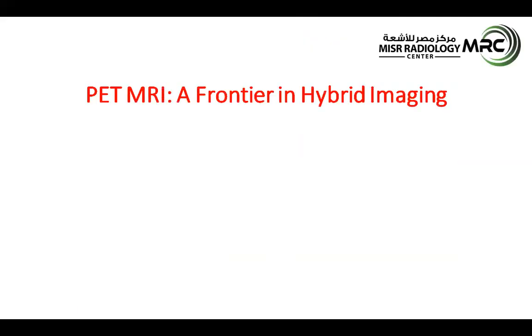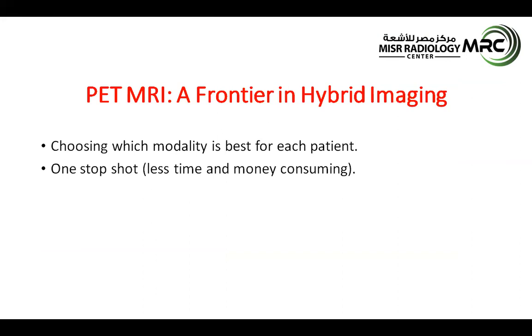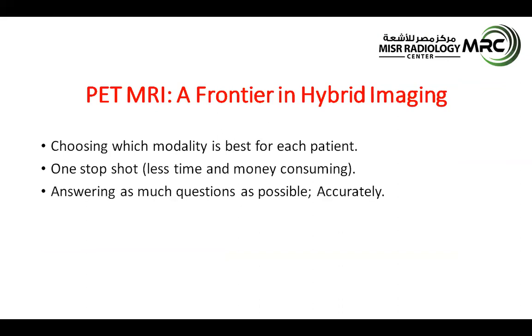So we can consider PET MRI as a frontier between what was done in hybrid imaging before and what is done in hybrid imaging now. So it is important to choose which modality is best for each patient. It is considered one of the one-stop shop examinations, so it is less time-consuming and less costly. The importance of answering as many questions as possible.